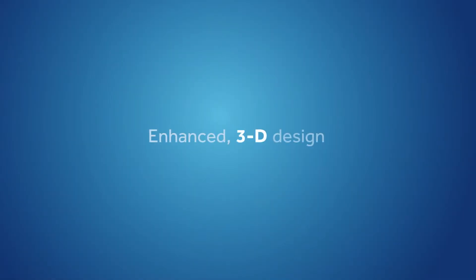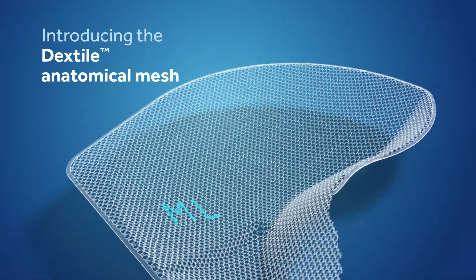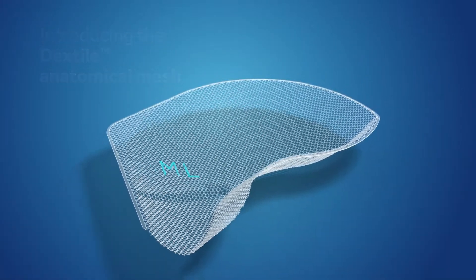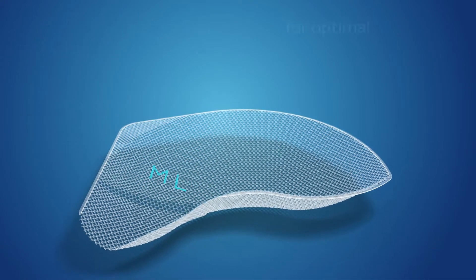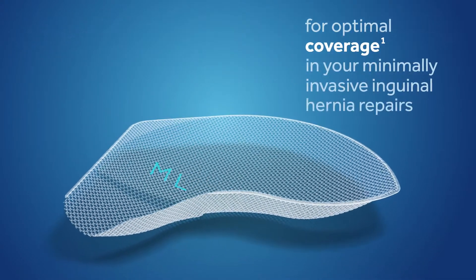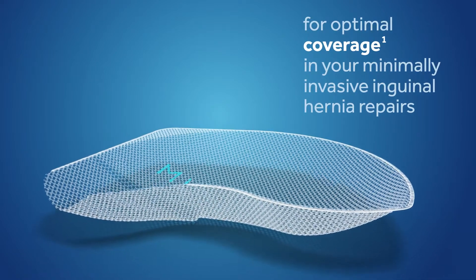Discover enhanced three-dimensional design adapted to your patient's anatomy. Introducing the Dextile Anatomical Mesh — designed and developed in close partnership with surgical experts like you for optimal coverage, integration, visualization, and handling in your minimally invasive inguinal hernia repairs.